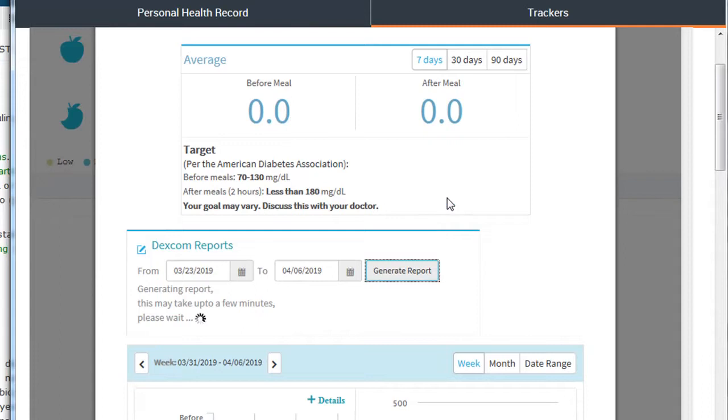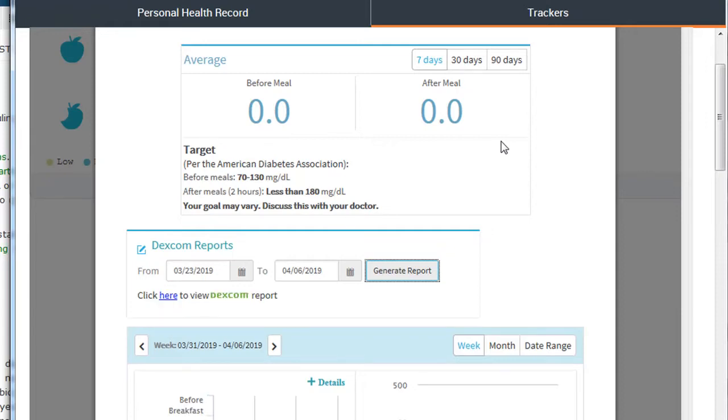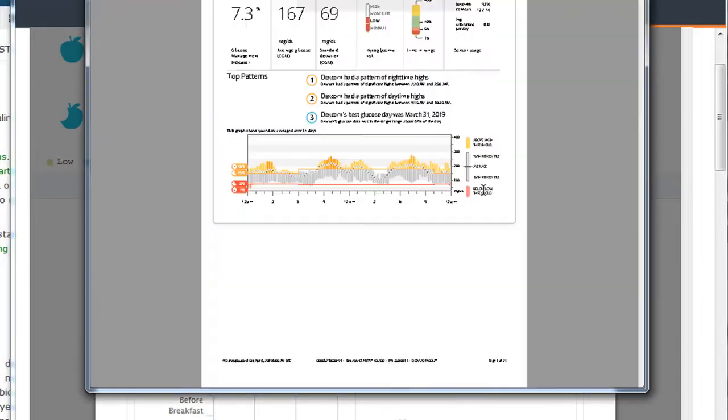You can change the date of the Dexcom reports, then click Generate Reports. It defaults to two weeks. It takes a few seconds to generate the report. Then you get a blue link that launches a PDF.